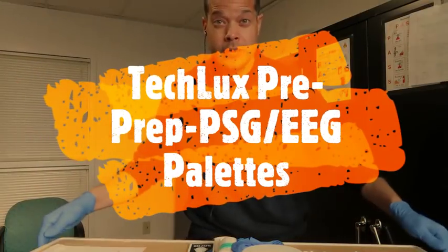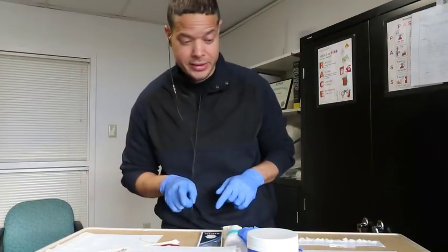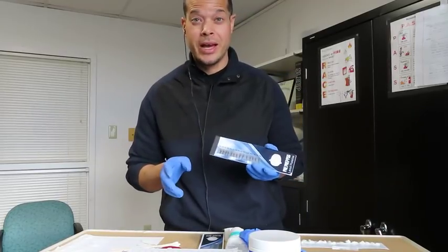What we're going to do today, we're going to be teaching you and showing you how to use these EEG palettes, and there's quite a few models that I have. So what I'm trying to do today is just show everyone how to use these palettes.